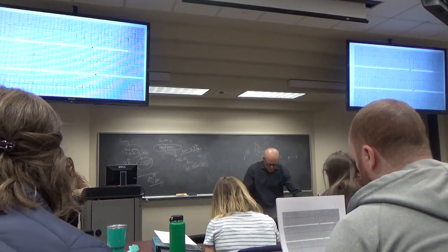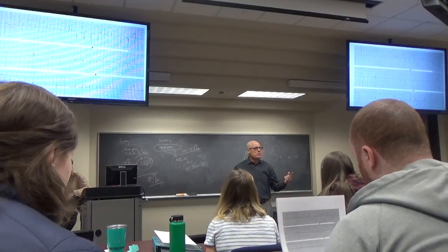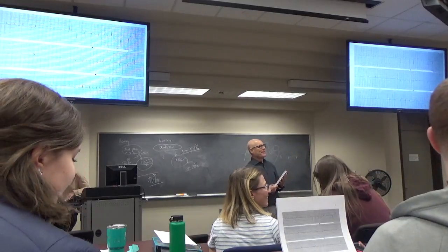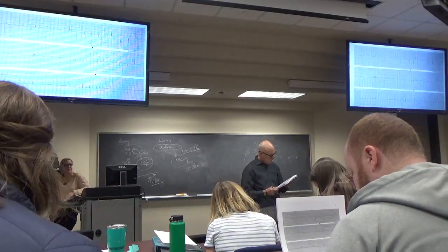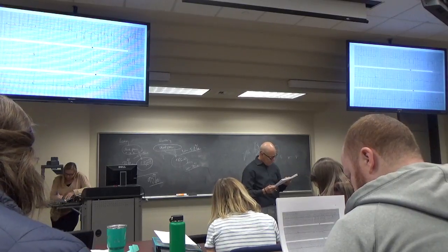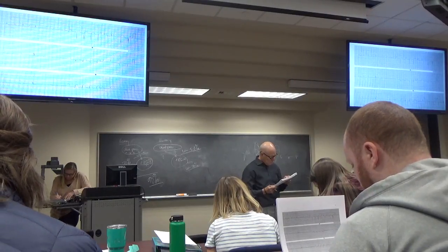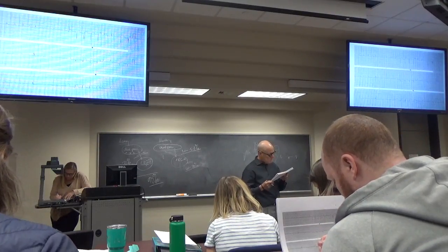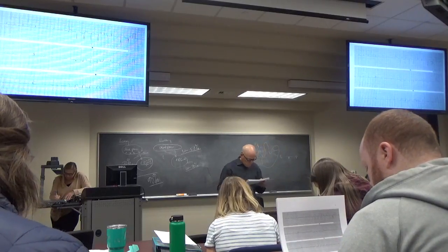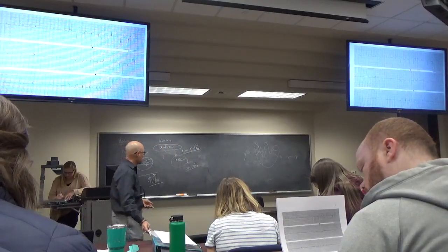Oh my goodness. Does anyone want to volunteer for this one? Courage! I got a sinus rhythm, tachycardic, rate of 105, a PR interval of 0.12, QRS of 0.08, QT of 0.32. The axis was normal at plus 33. So sinus tachycardia was the conclusion.